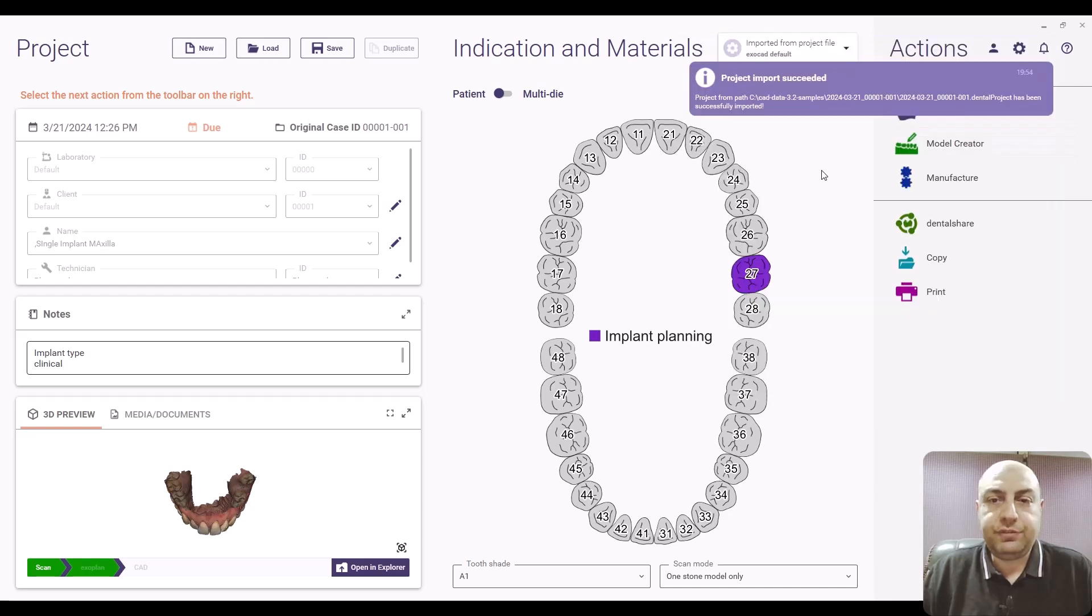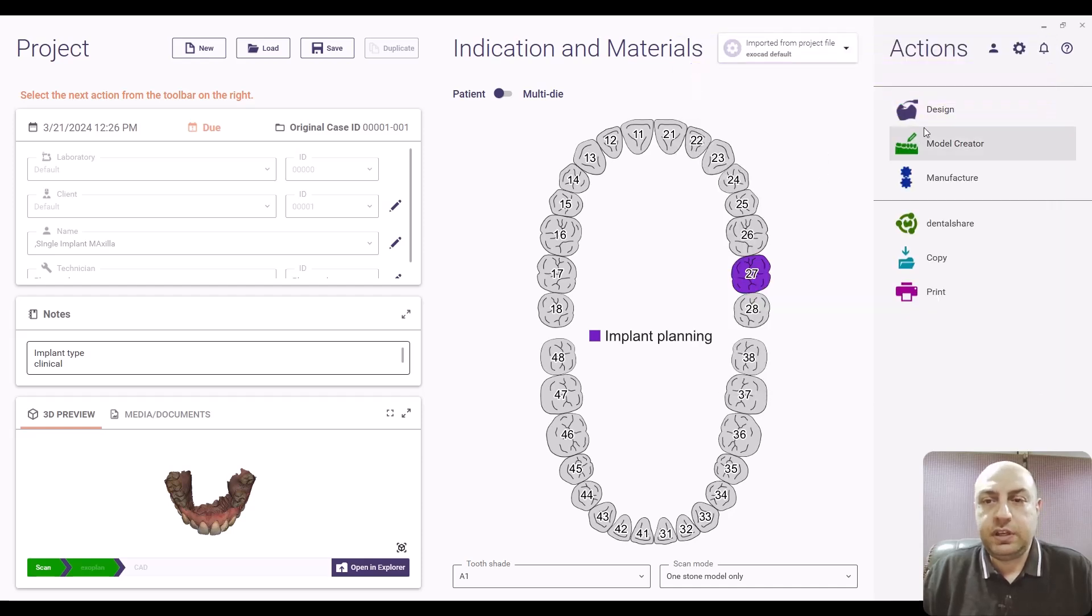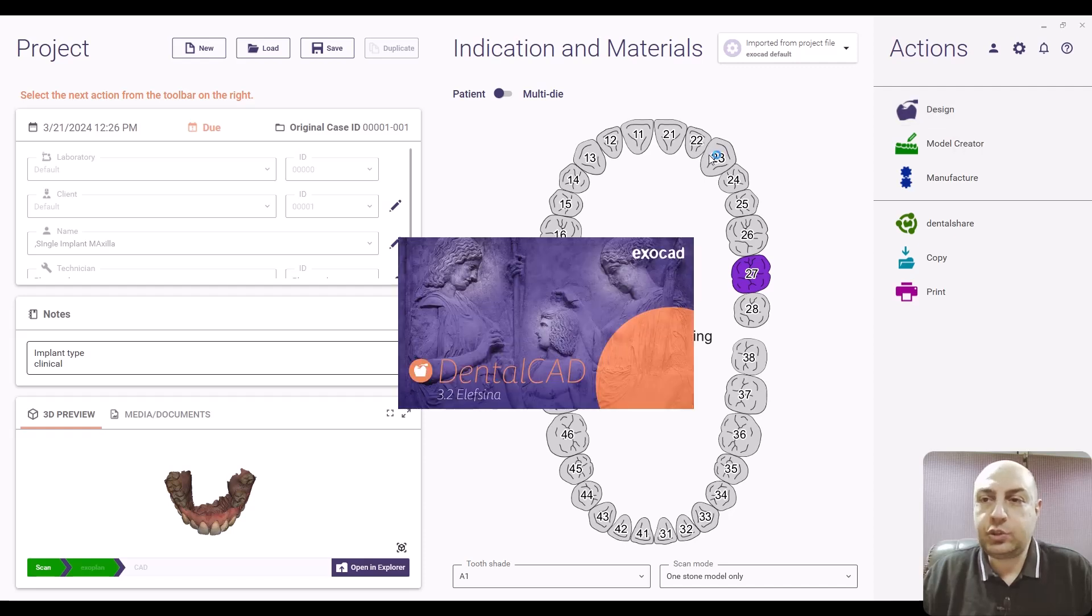If you want to modify the name and so on, you will have the project on Exocad.